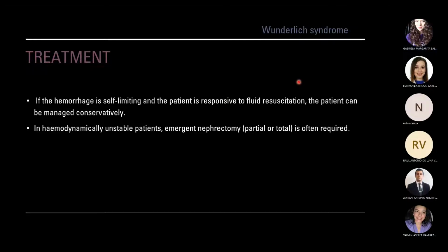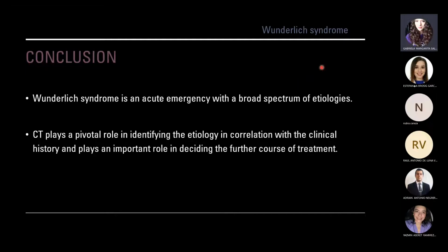And in conclusion, Wunderlich syndrome is an acute emergency with a broad spectrum of etiologies, and CT plays a pivotal role in identifying the etiology in correlation with the clinical history, and plays an important role in deciding the future course of the treatment.